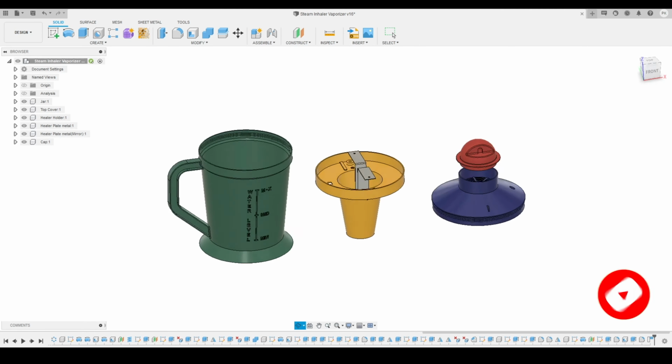We'll go into the create panel over here, and we'll click on the new component, and I'm going to give a name to this particular component. So I will just write jar, and I will press OK. So you can see that I had just created a component, and it is active right now.